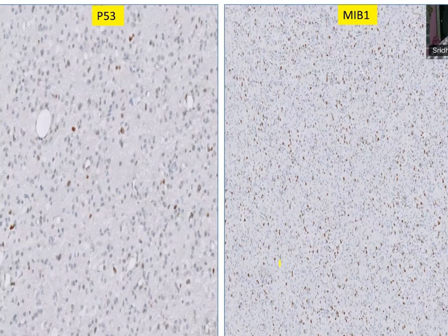So at this point of time, what exactly are your differentials? It must be a glioblastoma, wild type glioblastoma. So you had 2 differentials here because of the 3 groups. One you could exclude. It is definitely not IDH mutant astrocytoma because ATRX is not lost. That is out. Between these 2, you cannot distinguish oligo and this based on IHC findings. But morphologically, you felt it is more of an astro. That's the feature which goes against oligo.